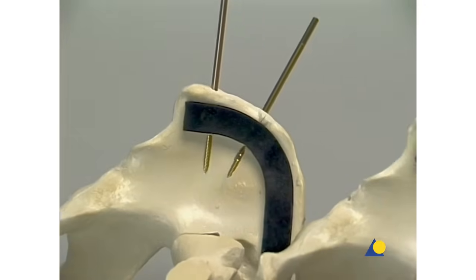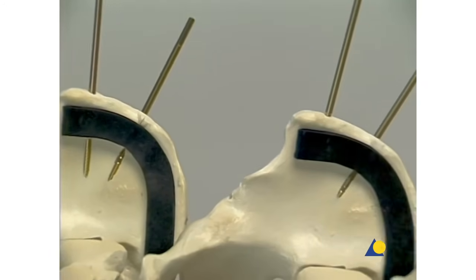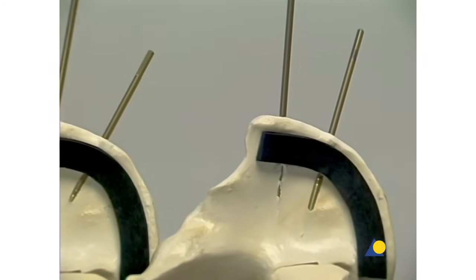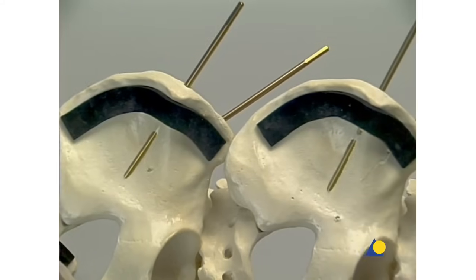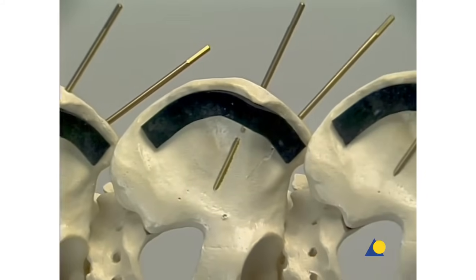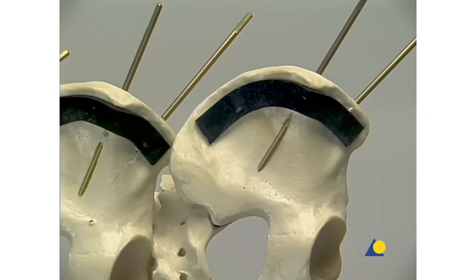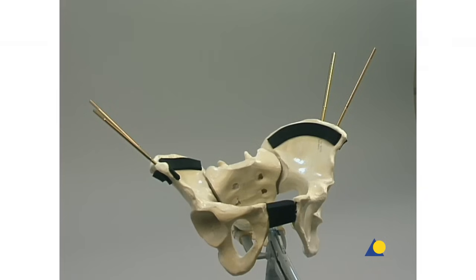Even experienced surgeons find it difficult to place the Schantz screws in the best position because partial perforations of the thin ilium may occur in the inner and outer walls. However, perforations are acceptable if the tip of the Schantz screw is firmly anchored in the bone. On the opposite side, the Schantz screws are inserted into the iliac crest in the same way.